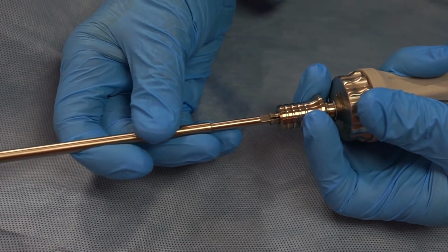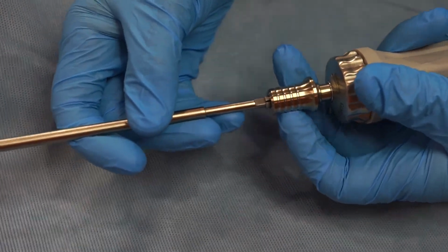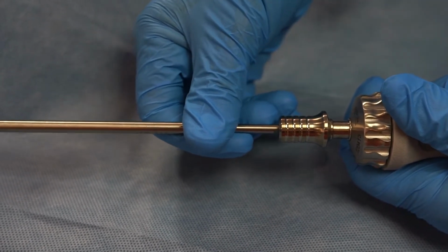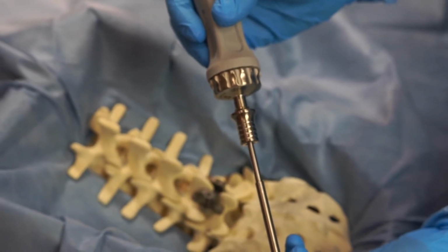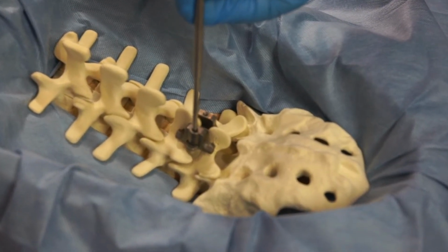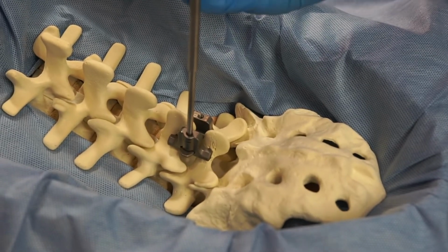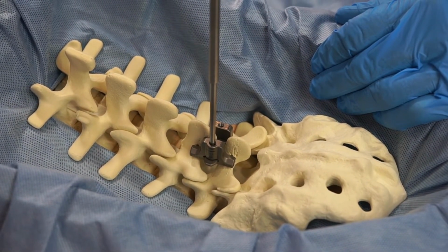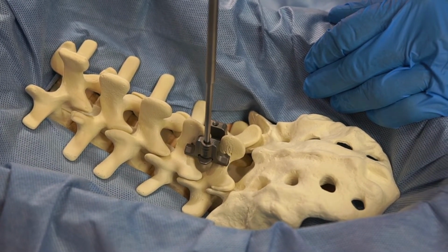Attach the gray removal handle to the torque driver. This can be verified by pulling on the shaft. Insert the removal handle assembly into the set screw of the implant to remove. Do not use the black torque handle for removing the set screw. Use the removal handle assembly, turning counterclockwise to loosen the set screw.